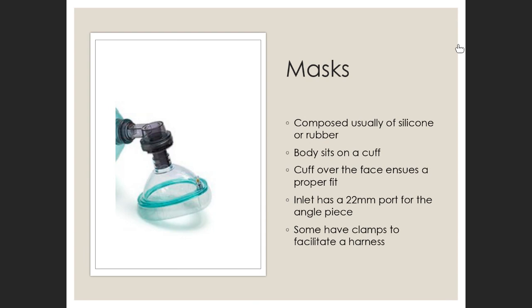So much so that for students, we have actually moved away from them absolutely needing to intubate. If they learn to intubate, that's fine, and we teach it, that's no trouble. But we require of them two basic airway skills they absolutely need. They must be able to handle the airway with a mask and an inflatable bag, and they must learn to put an LMA in. Very important.